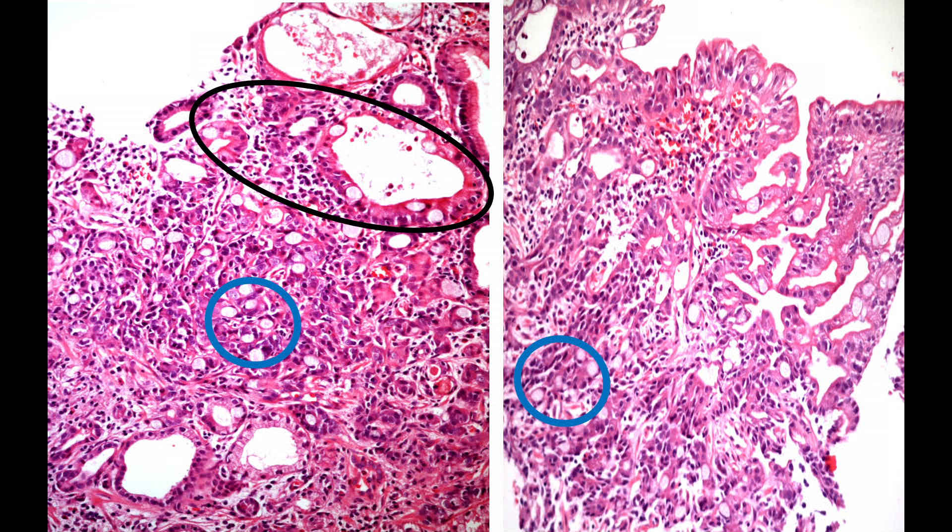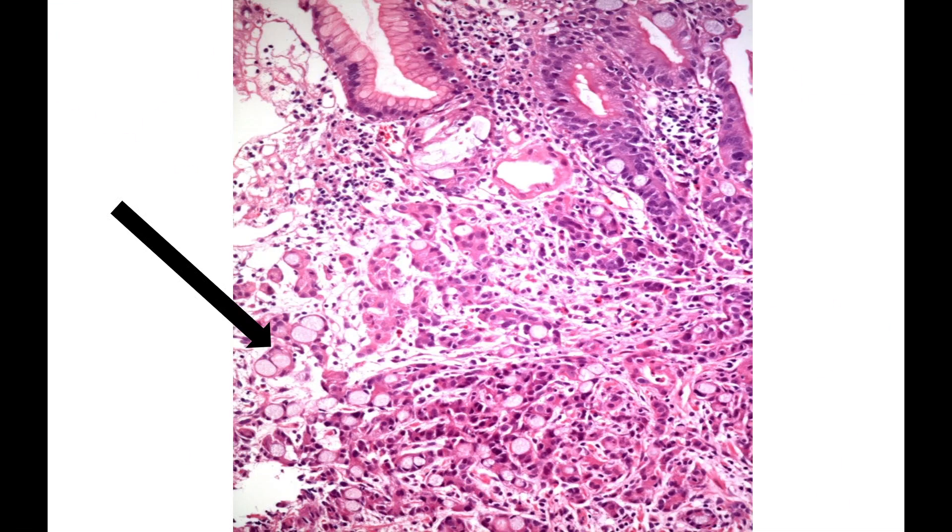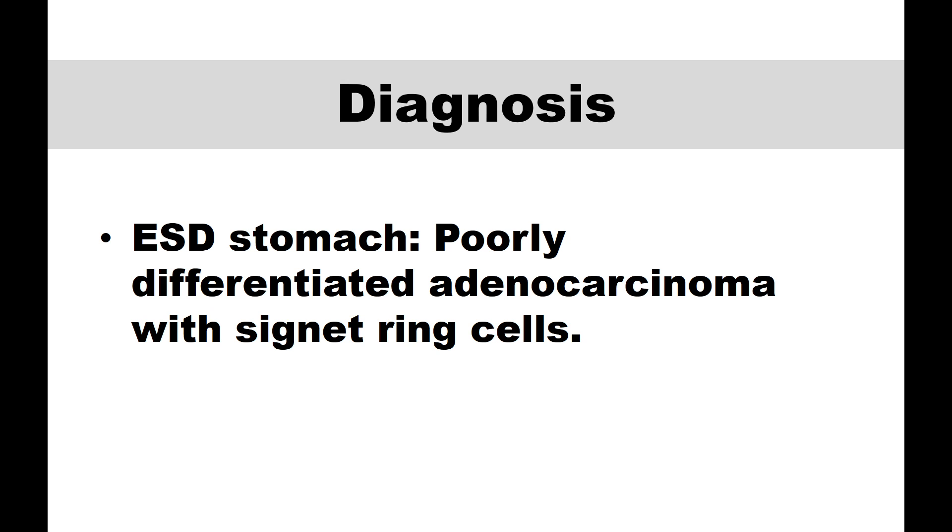Here you can see the blue-marked vacuolated cells, and at higher magnification you can clearly see those cells and interpret them as signet ring cells. So we have a mixed adenocarcinoma with signet ring cell appearance — a poorly differentiated adenocarcinoma with signet ring cells.